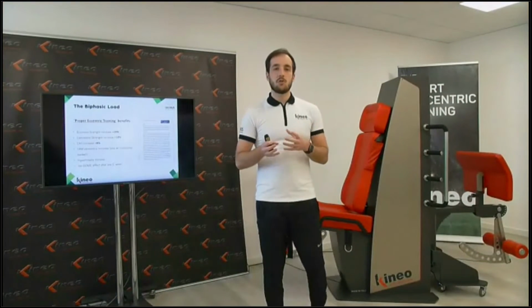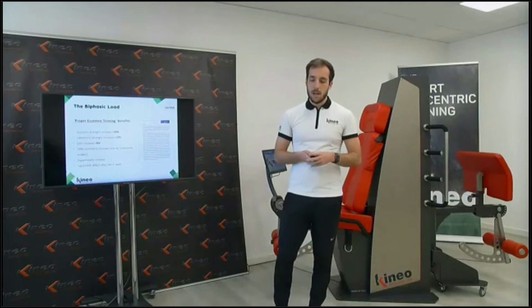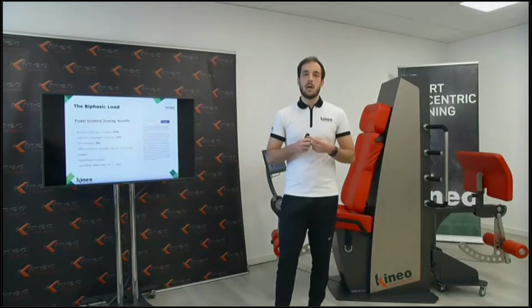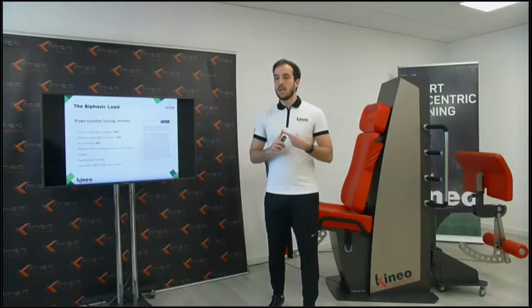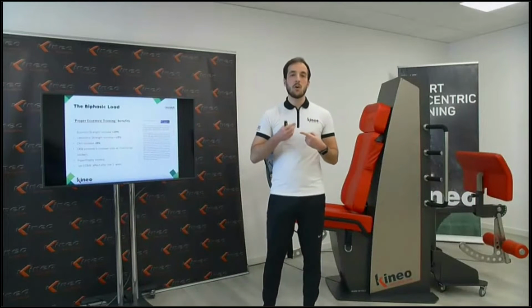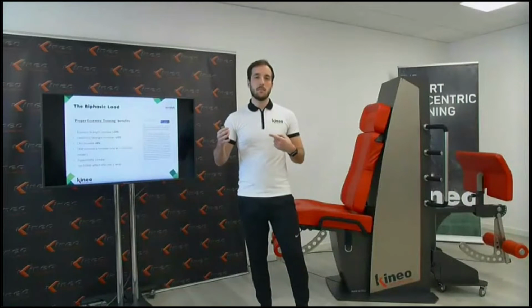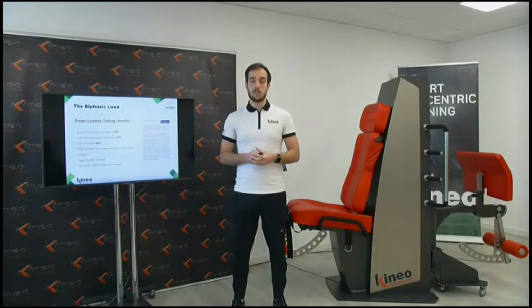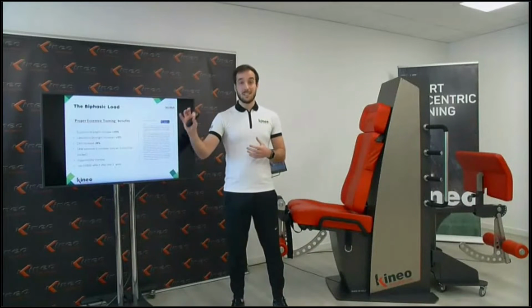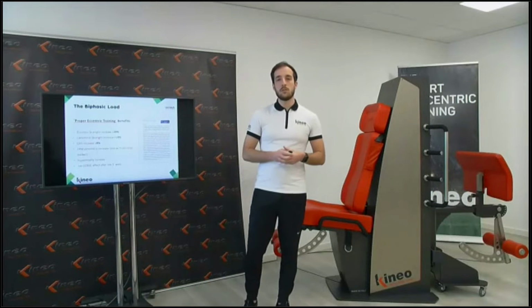And I don't want to be so long, but there is the no DOMS effect. We always heard talking about eccentric as sometimes a dangerous way to train, because we are afraid of DOMS, delayed onset muscle soreness. And in fact, there are 2 points to keep in mind. If you train eccentric, you will have what is called the repeated bout effect. The repeated bout effect is basically the effect of eccentric loading made in a constant way each week for a long time. It makes sure that there is an adaptation, a kind of adaptation that doesn't involve DOMS anymore in this practice. So it's not true anymore that eccentric training, if done properly, with data quantification, with objective loads, and not just 2 legs up and 1 down, is dangerous. It is definitely a safe way to do eccentric.